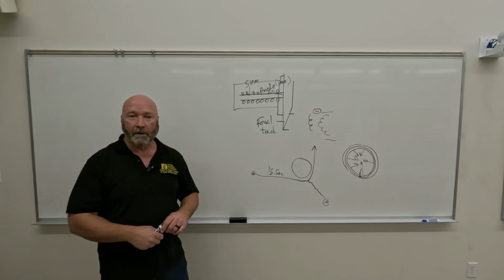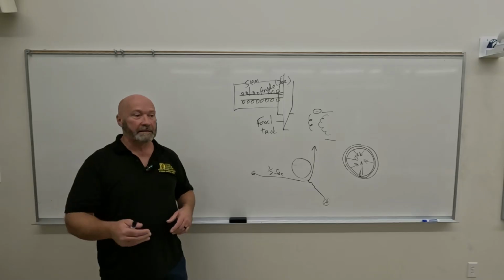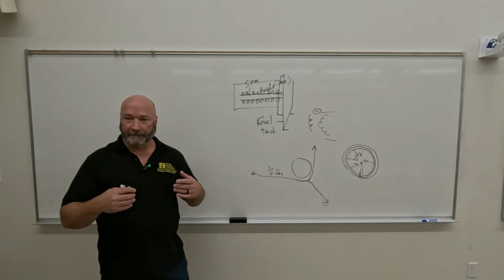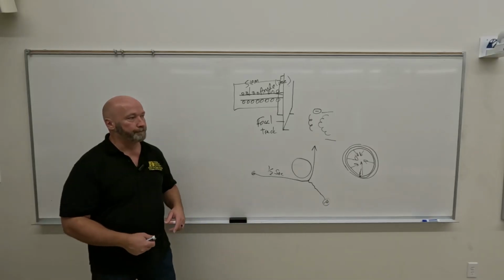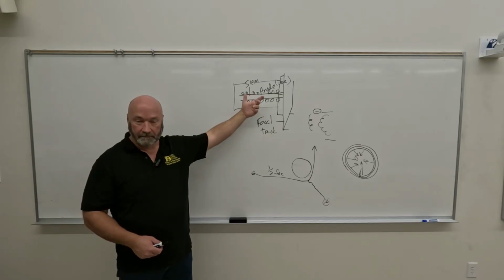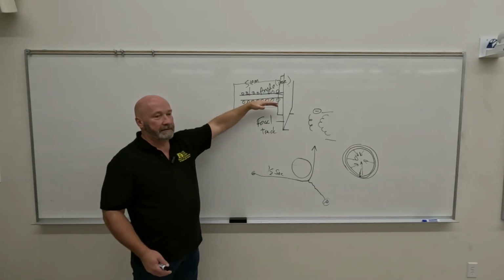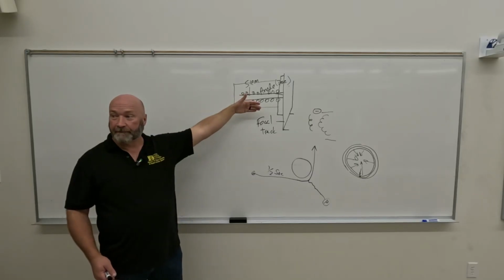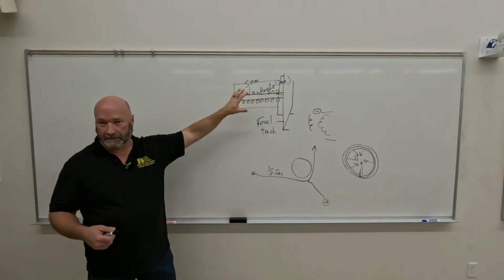You change the oil in your car. If you've never done oil changes in your car, your oil gets exhausted. When you pour it in, it's yellow. When you drain it out, it's black. If it's been cooked long enough, it just exhausts. It's the same thing that's going to happen to these. Why? Because thermal radiation gets hot, right? So eventually that grease is going to be exhausted, and once it gets exhausted, it's going to be less efficient. So the bearings have a harder time turning.